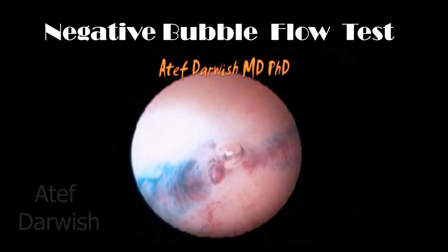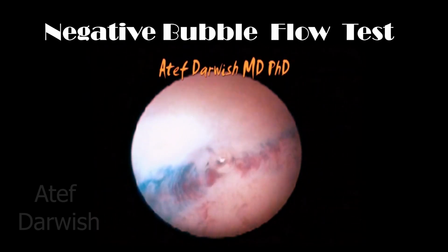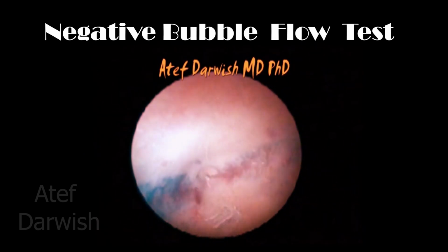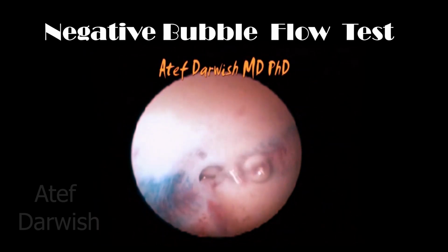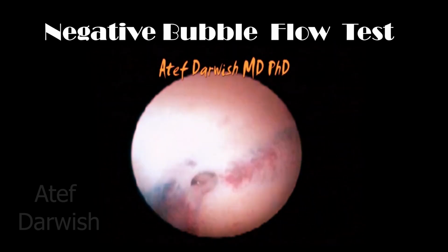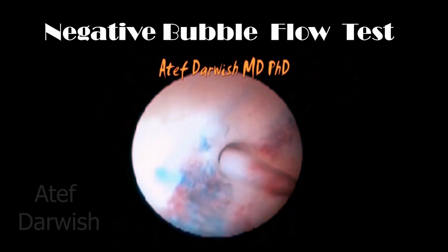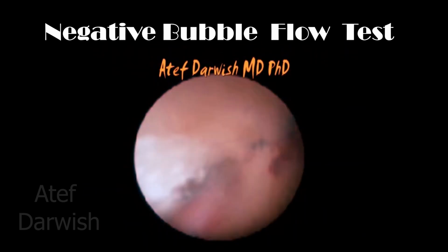In this case, you can see the air bubble trying to go inside the Darwish triad, but due to the presence of a polyp inside this triad, the air bubbles cannot cross the triad to go inside the fallopian tube. This is called a negative bubble flow test, and the cause of negativity is clear here due to this polyp. A negative bubble test may be due to adhesions, fibrosis, adenomyosis or subserous myoma.